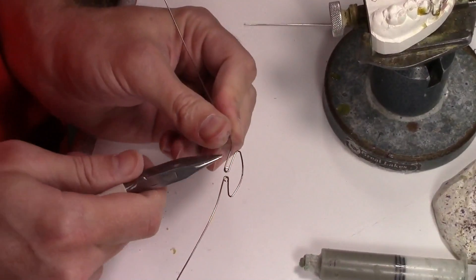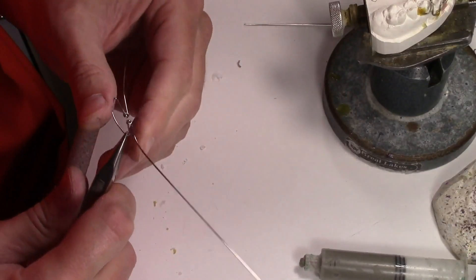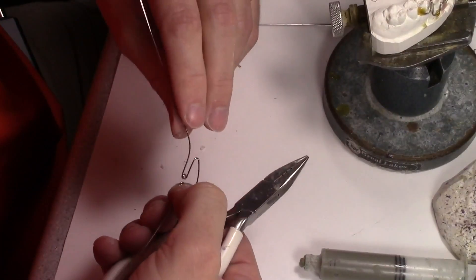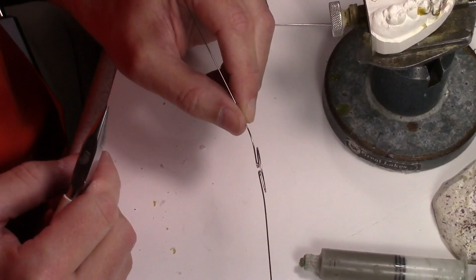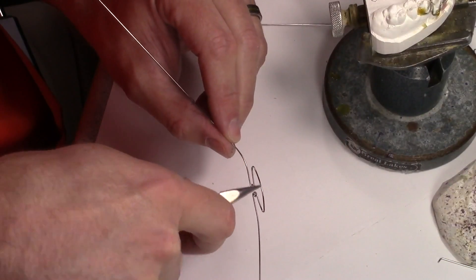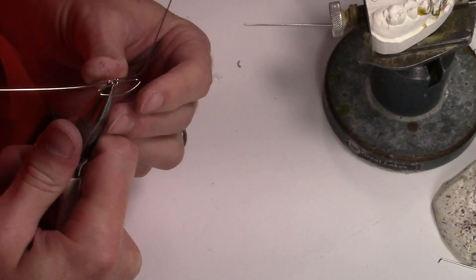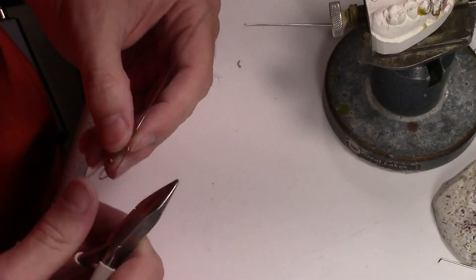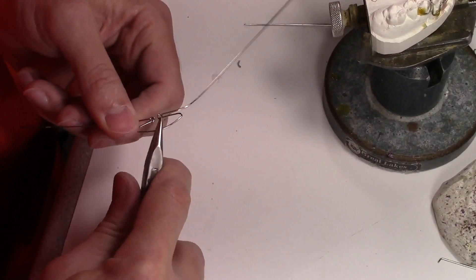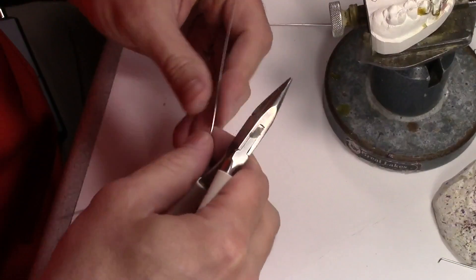Going around, I make my wires parallel to each other, so I have the option of bringing these closer together. I don't like one bending down and one bending up, so I got those pretty parallel. Now you can see how flexible this is — you've built a lot of slack into the wire which makes it bend and give a lot easier.